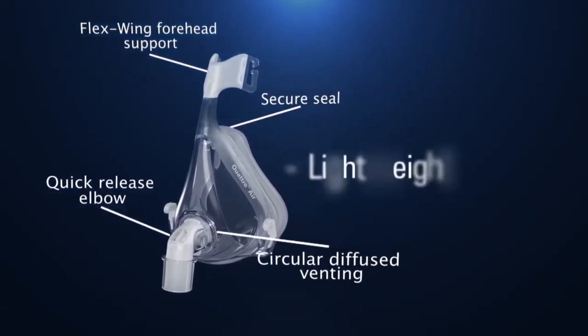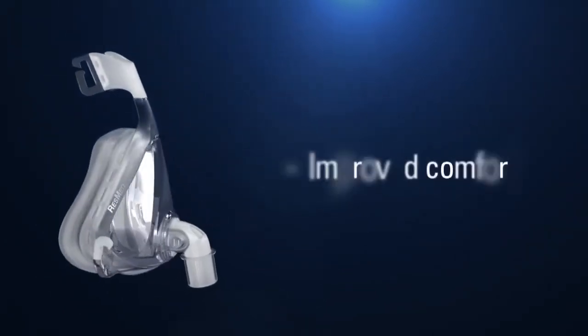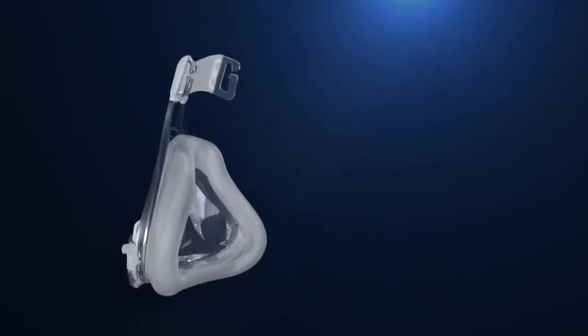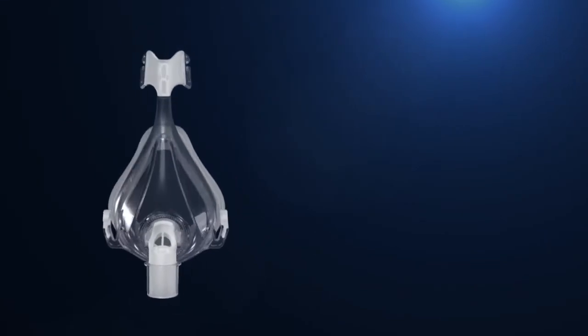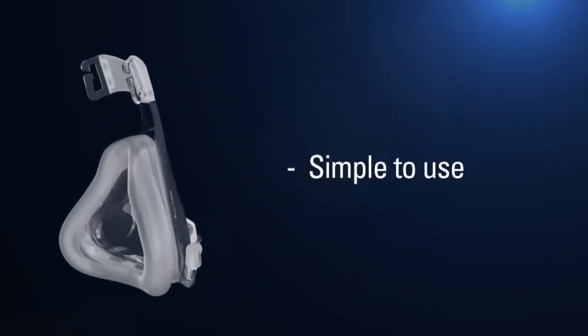Quattro Air is the lightest full face mask on the market. Plus, it offers your patients improved comfort over the previous Mirage Quattro. And with just four parts, Quattro Air has the fewest number of components of any conventional full face mask, making it easy to use and clean.